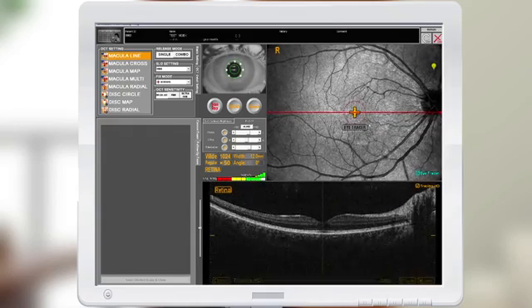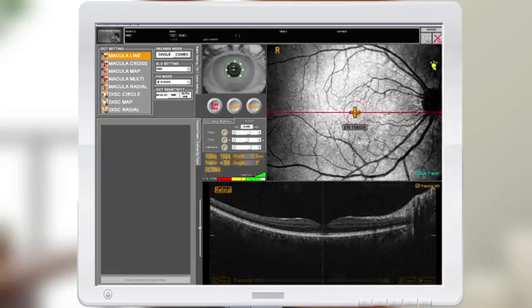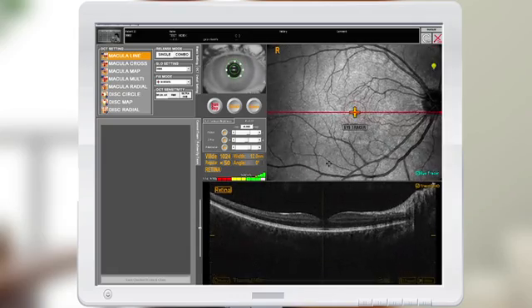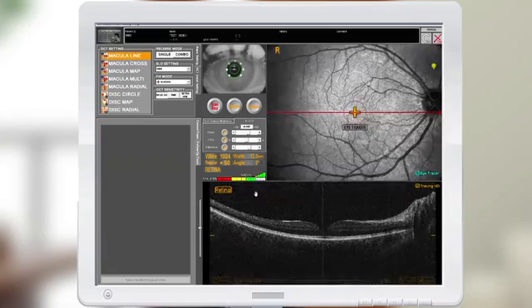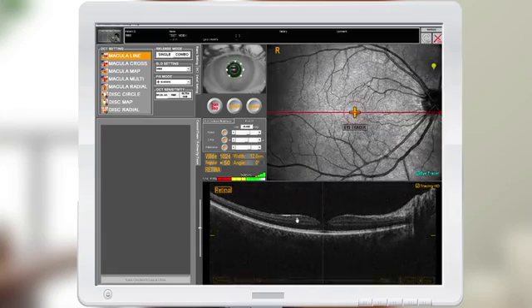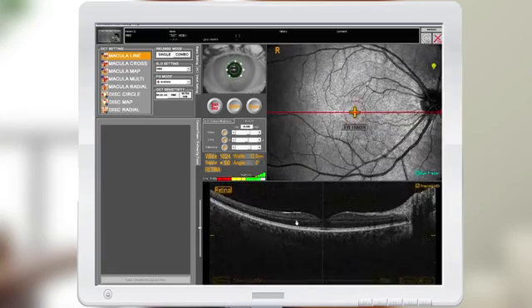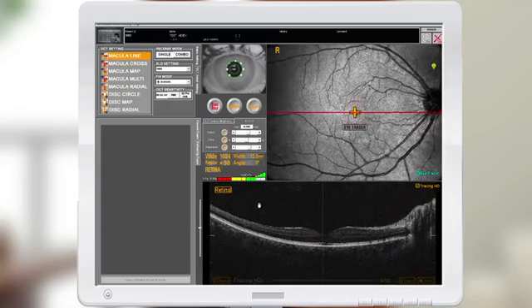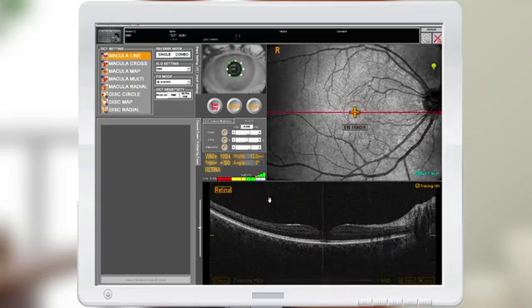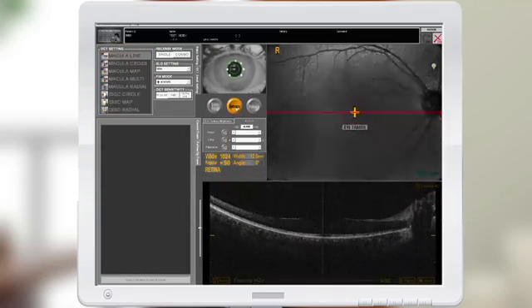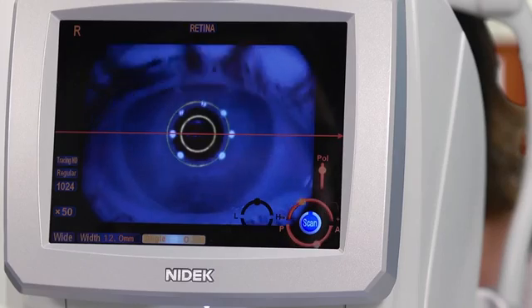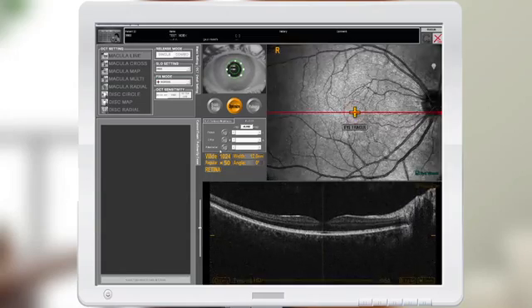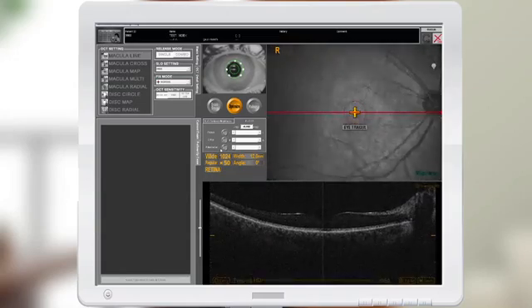If your quality image is low, you can adjust by selecting the light bulb. The signal strength index is the quality of your B-scan image. If the signal strength index is low, select the optimize button, which will auto-focus, auto-Z position, and auto-polarize the OCT signal.